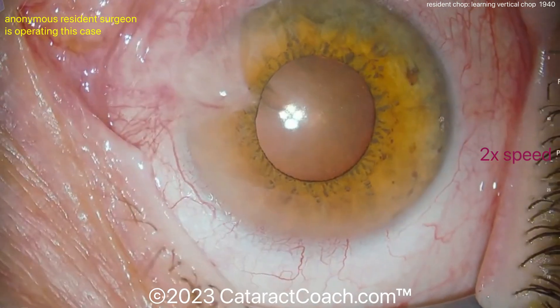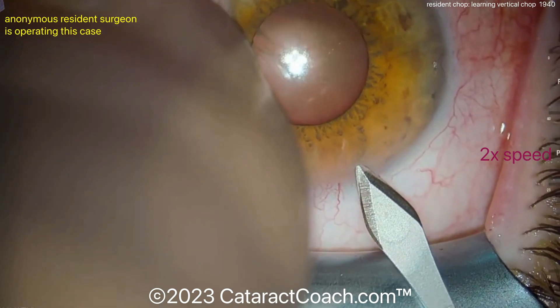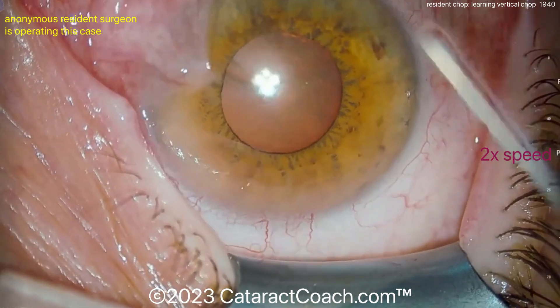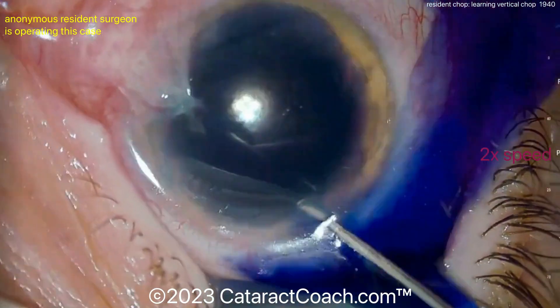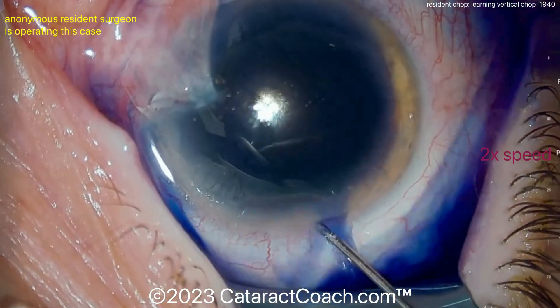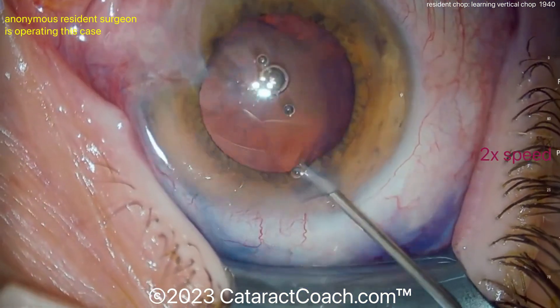The first thing you notice is that's a honking pterygium — a big pterygium here. You may want to remove that ahead of time because it's undoubtedly inducing some astigmatic issue in the cornea, and it's going to be more challenging to get accurate lens calculations. I would prefer to remove that pterygium ahead of time, let the eye heal and stabilize for a few months, and then come back.